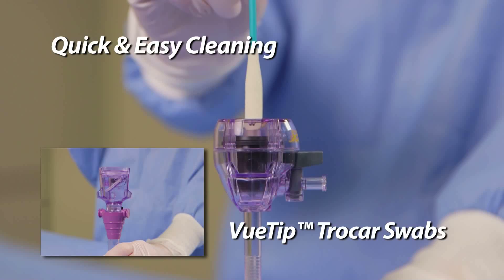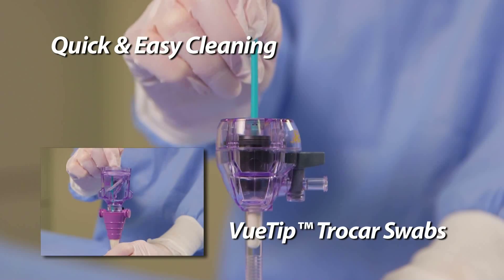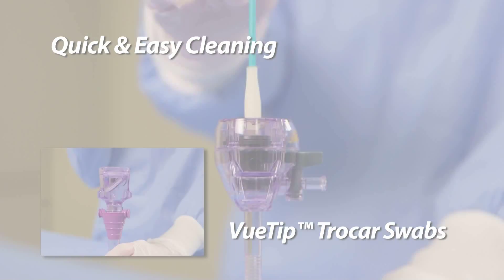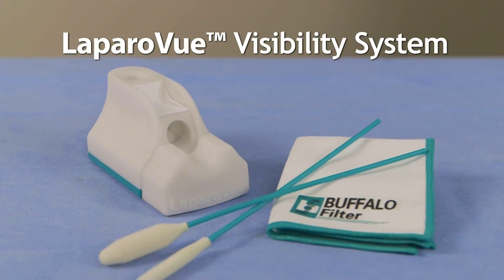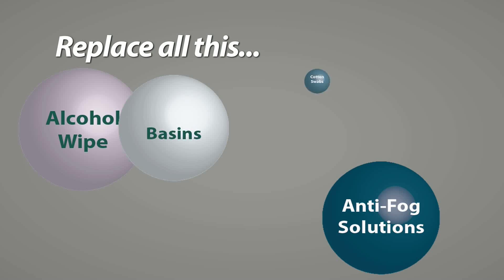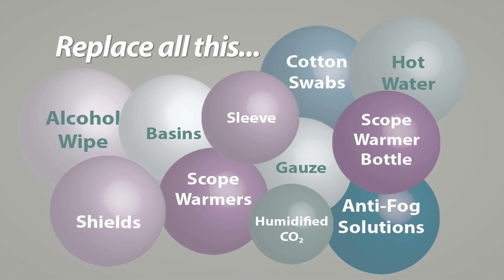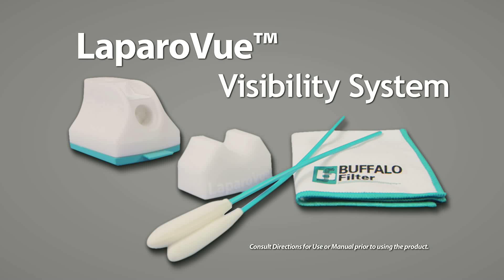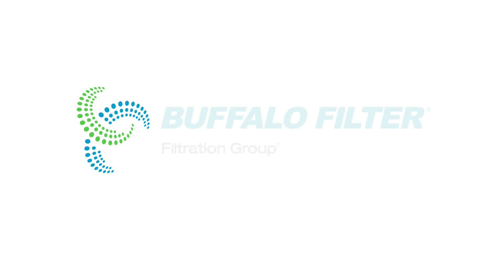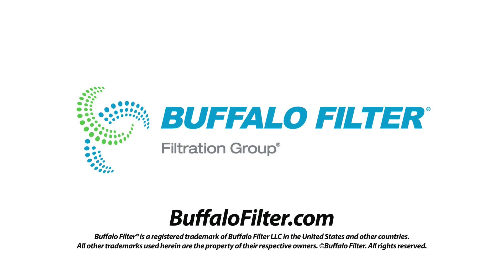If necessary, the trocar cannula can be cleaned using the radiopaque small or large VueTip trocar swabs provided. LaparoVue Visibility System — change your view. Replace all this with an all-in-one solution. Contact Buffalo Filter to learn more about our LaparoVue Visibility System, product portfolio, and education programs to help your facility go surgical smoke-free.